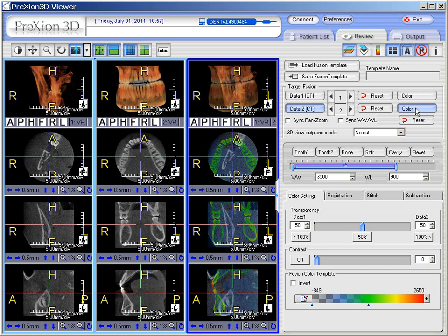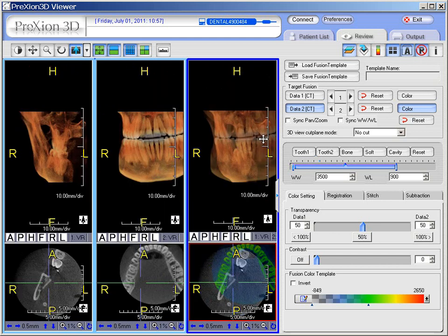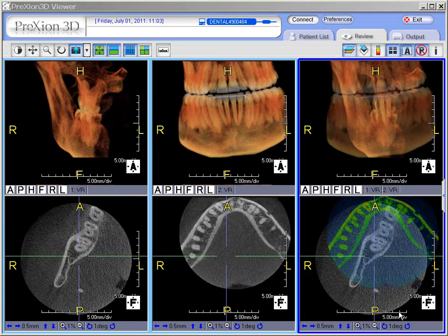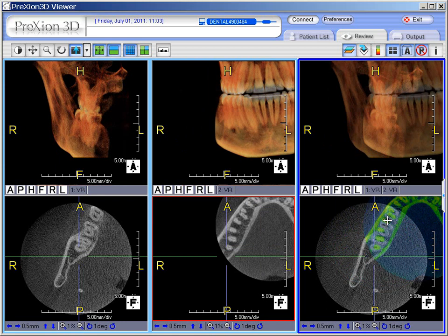The object here is to take the right side axial and superimpose it. The easy way to do this is to double-click the axial screen. We'll double left-click and load up the axial screen. We're always free to go back and forth between opening and closing the panel to get a better field of view, and then go back to the functions of the panel on the right side. To quickly align data set 2 over data set 1, right-click the mouse and drag the colored data set 2 to somewhat align with data set 1. It's not perfect at this point, but we're just beginning.